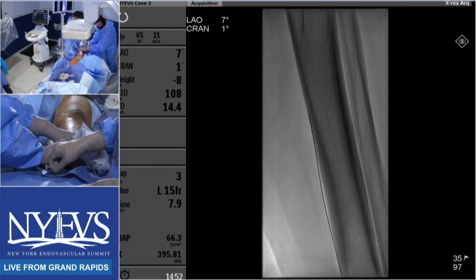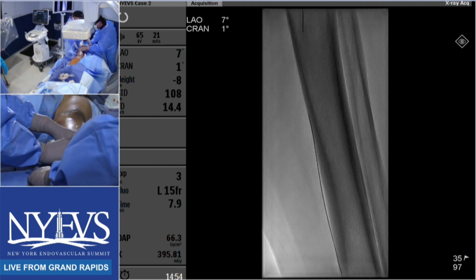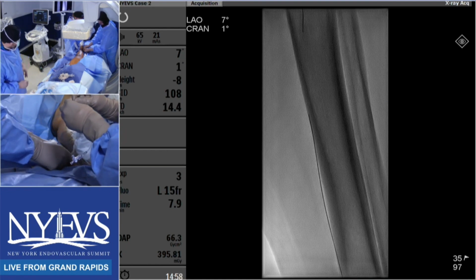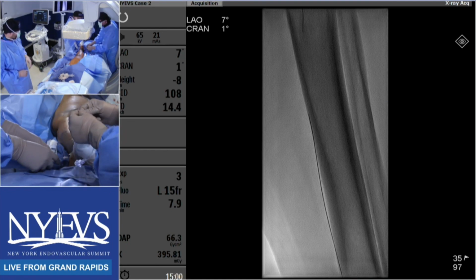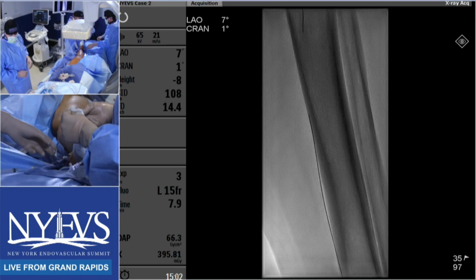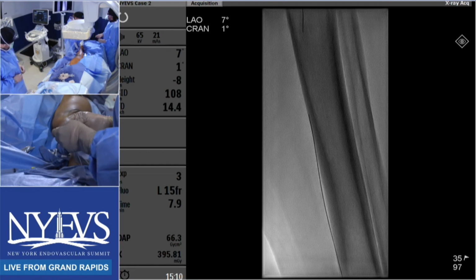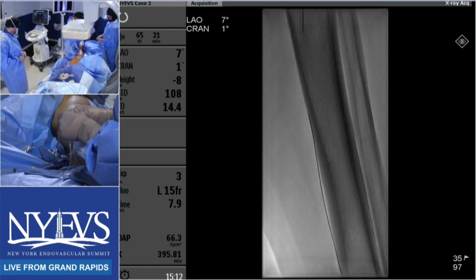I think this is a type 4 CTO based on CTOP. So I am hopeful that the wire is going to have a much easier time crossing the proximal CTO cap or crossing to the true lumen in a retrograde fashion. And I think this approach is a lot less dangerous than what I was attempting earlier because of all the collaterals that I saw in the PT.